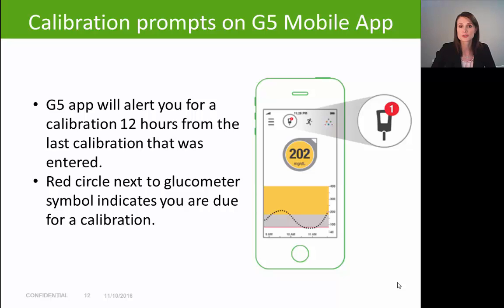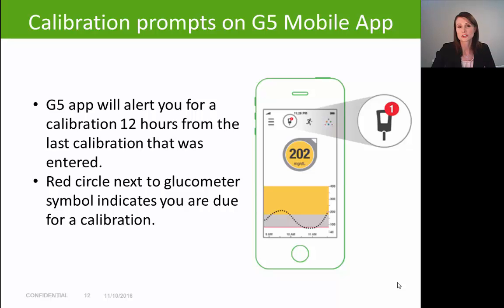The Dexcom G5 app is going to alert you every time you're due for a calibration — every 12 hours — prompting you to enter in a calibration. When you receive that alert, you'll see a red circle next to the glucometer icon; simply tap on that icon and manually enter your blood sugar value. If you do not see a red circle next to the glucometer icon, it means you're not due for a calibration or it's been less than 12 hours from your last calibration.